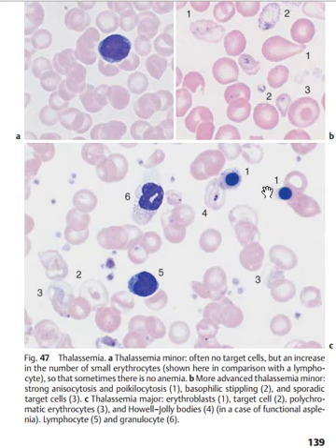You can visualize target cells. Is it clear? So the 2 are the target cells. So when things look just like this, you have target cells. Those are thalassemia major. You can visualize it. In thalassemia major still, you can see polychromatophilic cells. So diagram 1, sorry, diagram 3 are polychromatophilic cells. Now diagram 4 is going to show Howell-Jolly bodies.